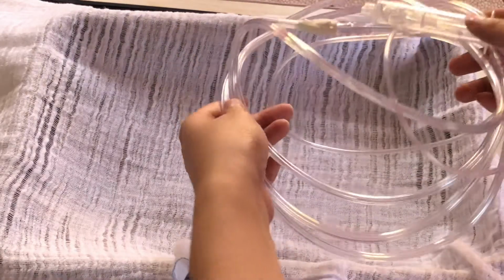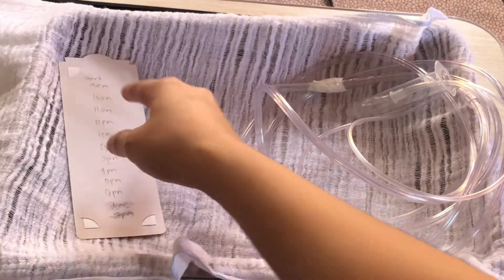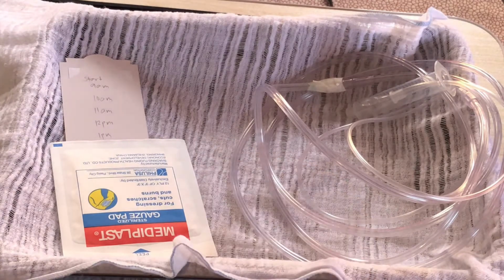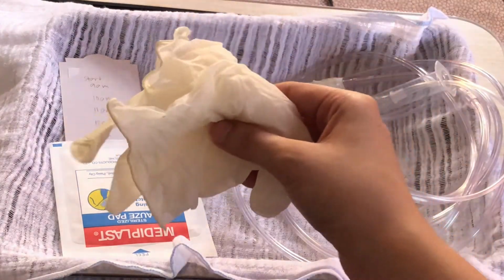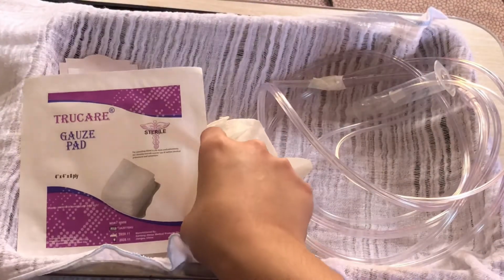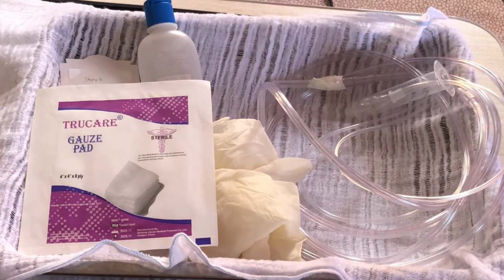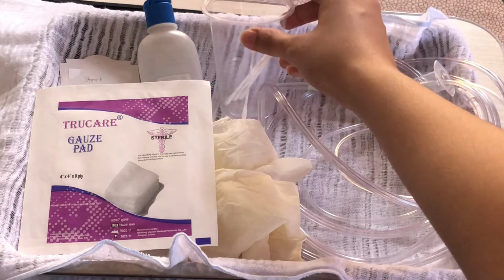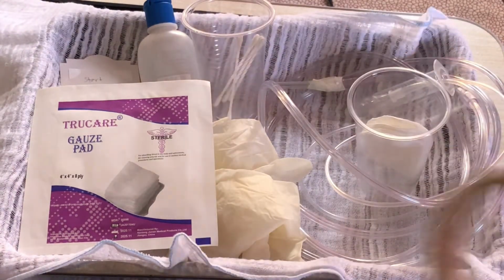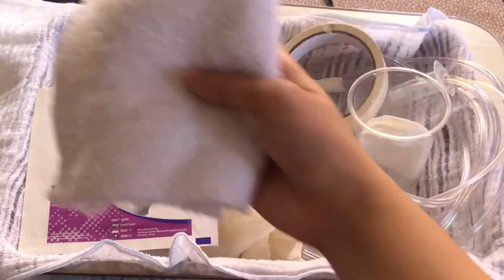Administration set including sterile tube and drip chamber, timing label, sterile gauze for positioning the needle. For the dressing, clean disposable gloves, sterile 4x4 gauze, adhesive remover, chlorhexidine swabs, alcohol swabs, tape, and towel.